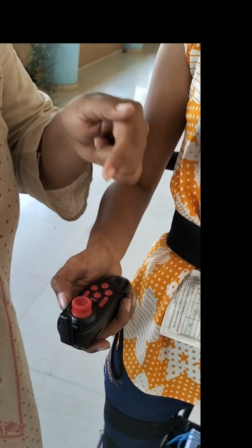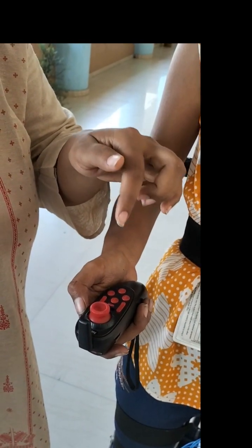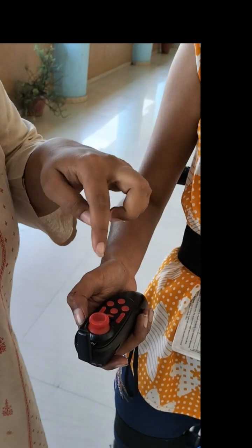Using the RC transmitter we can move left, right, forward, and backward, as well as control the speed. This RC transmitter is connected by the controller to the receiver. The working of this RC transmitter operates through the receiver.